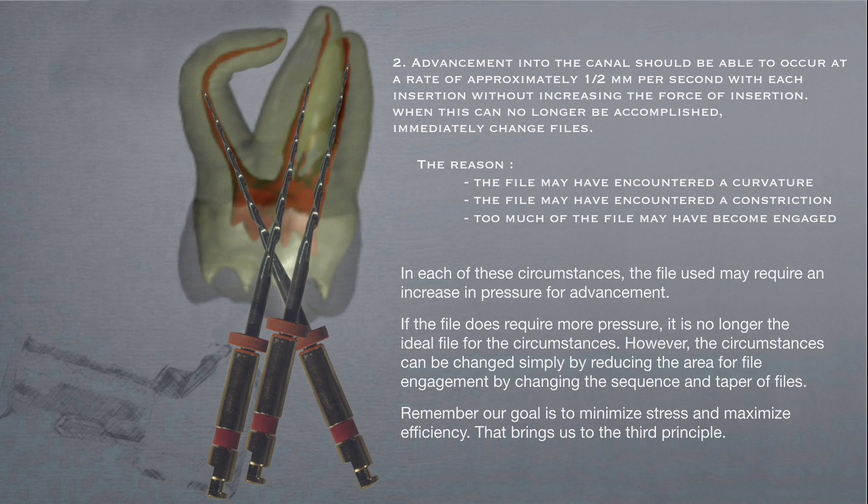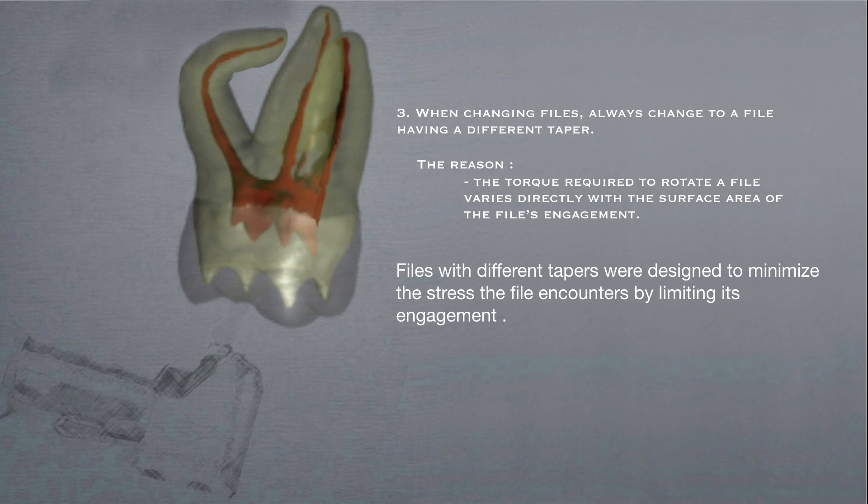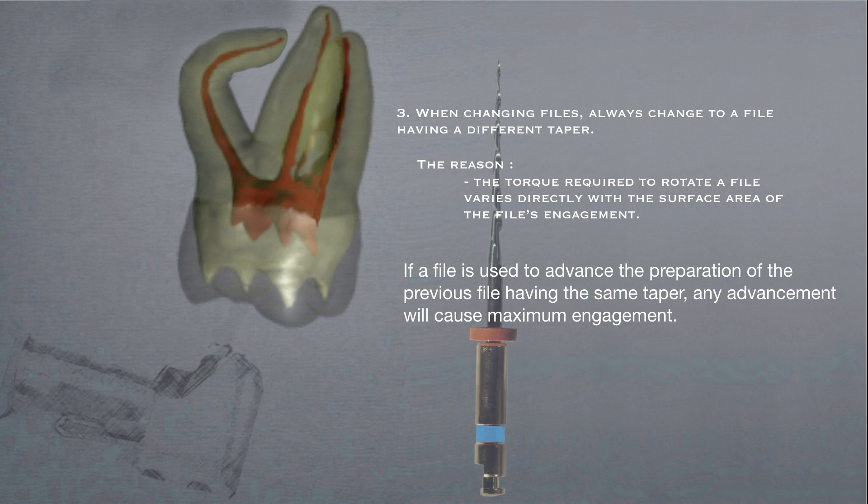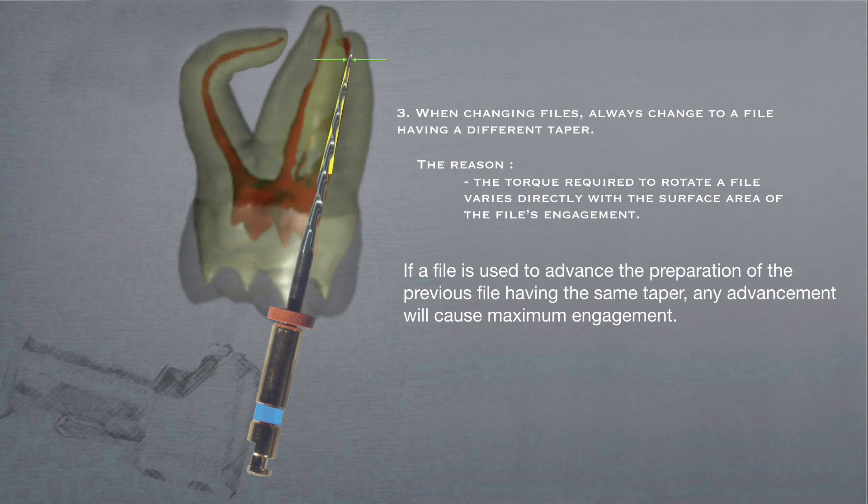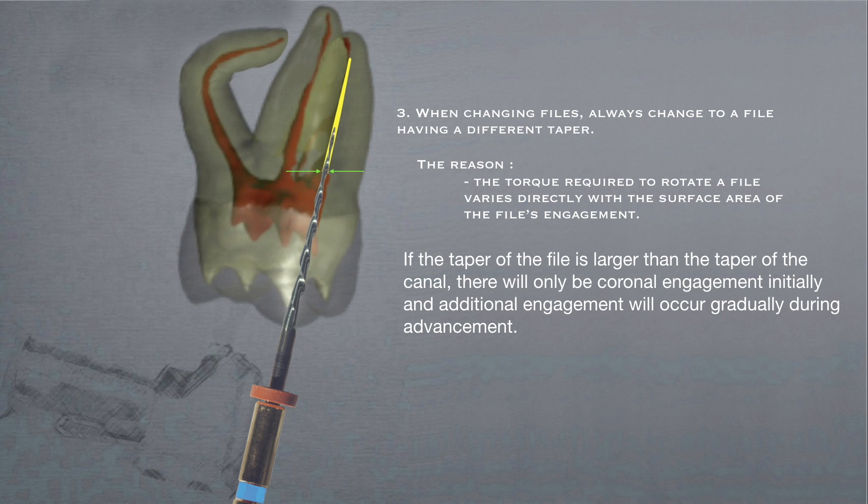And that brings us to the third principle. When changing files, always change to a file having a different taper. The reason? The torque required to rotate a file varies directly with the surface area of the file's engagement. Files with different tapers were designed to minimize the stress the file encounters by limiting its engagement. If a file is used to advance the preparation of the previous file having the same taper, any advancement will cause maximum engagement. If the taper of a file is larger than the taper of the canal, there will only be coronal engagement initially, and additional engagement will occur gradually during advancement.